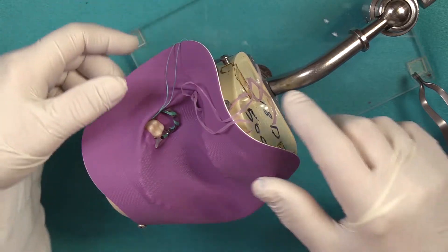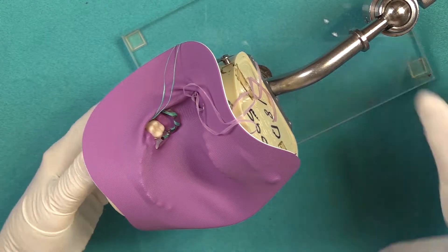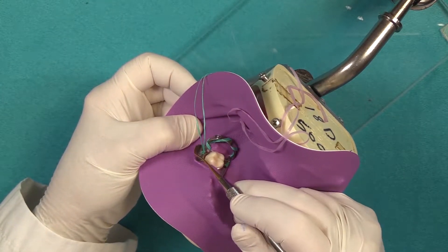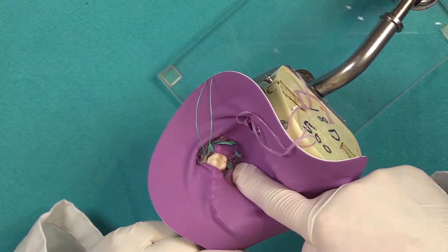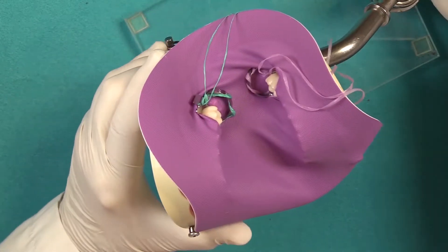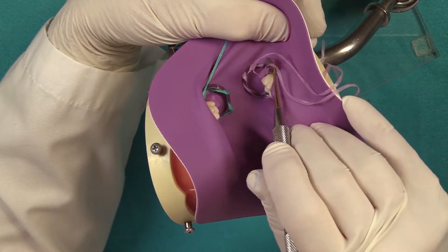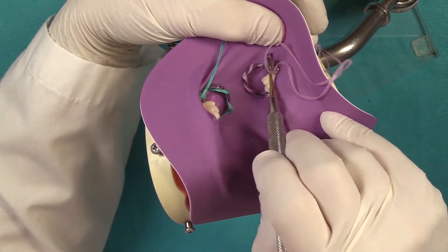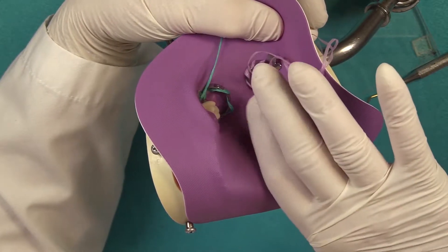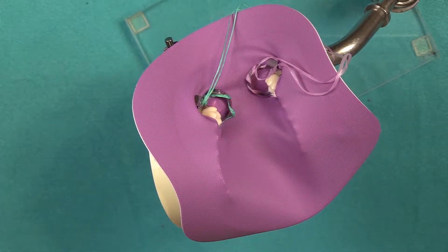Otherwise you're going to have too much tension on the dental dam in the posterior region. Now that that's done, we're going to stretch the dam off the wings — stretching your dam off the wings using a blunted composite instrument on its side, just like this. On the lingual, you can simply pull and stretch it off the wings. If you don't do that, you're going to get leakage. For the lower arch, move on and stretch the dam off the wings using the side of the instrument. Don't poke your instrument or you'll tear your dental dam. On the lingual, just pull sideways until you clear the wing. Now we're ready to do our Class 1 preparations and restore those teeth.